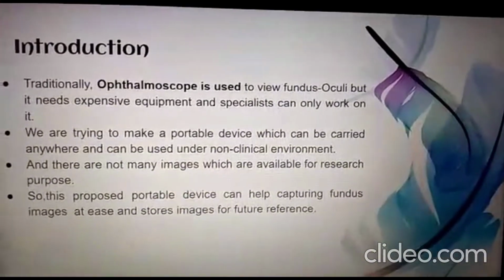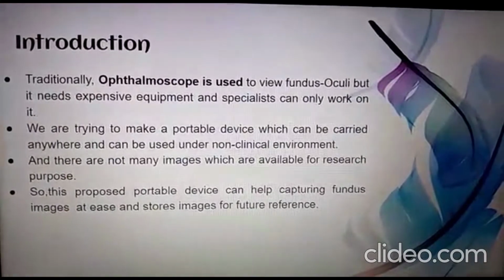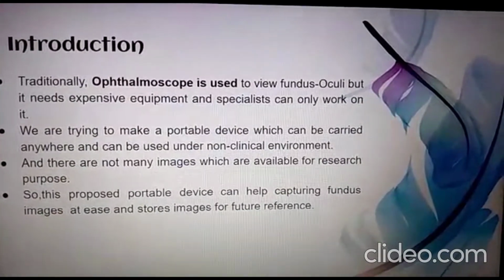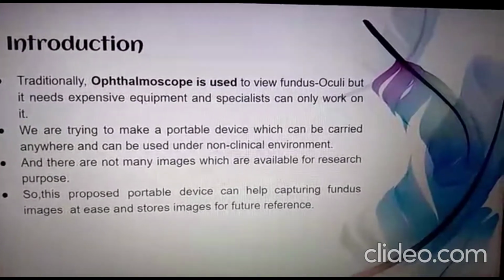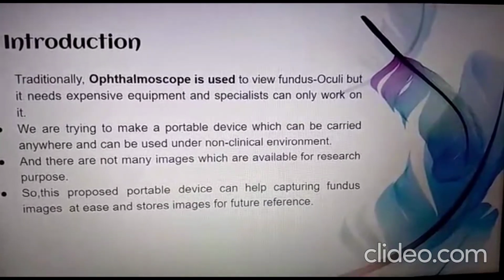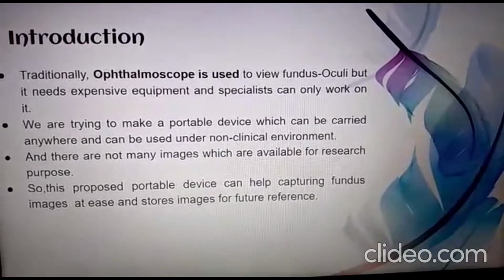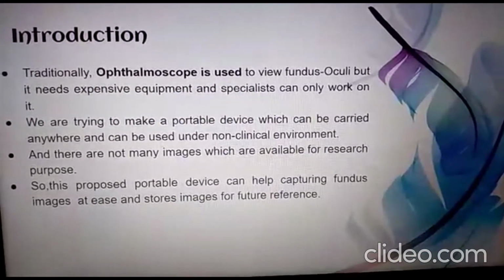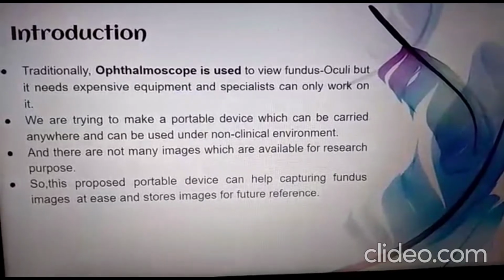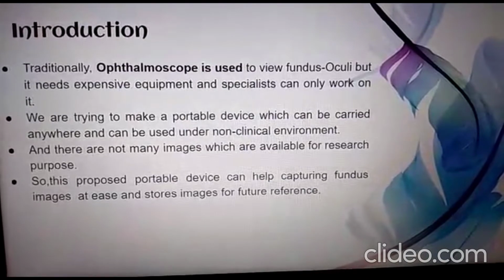So normally for the examination of the eye we use an ophthalmoscope, which is huge equipment and only specialists can use it. In rural areas we will not be able to find such equipment, which costs lakhs. So the people over there are not getting their eyes examined and are affected by different types of diseases before they are detected, which can even result in blindness.